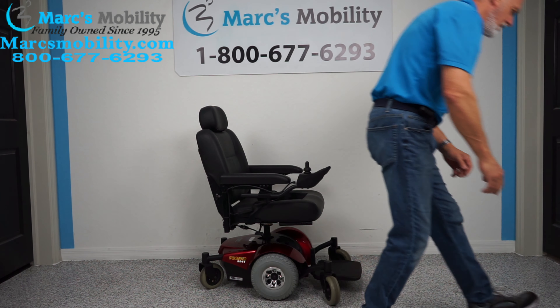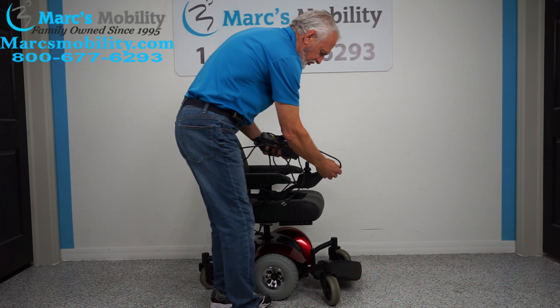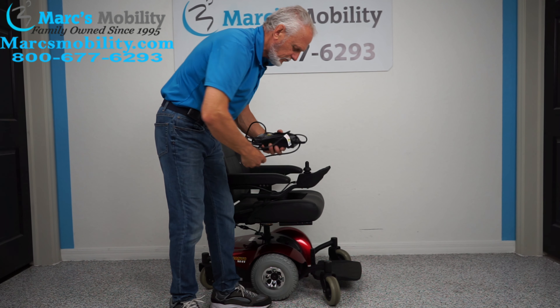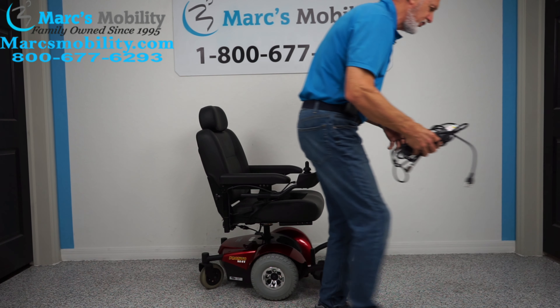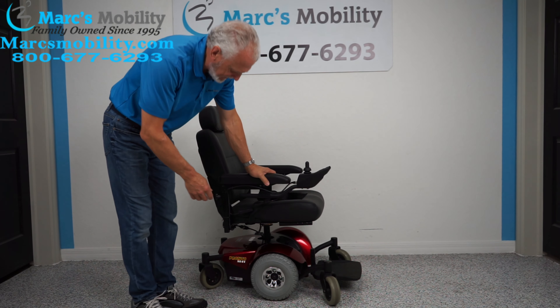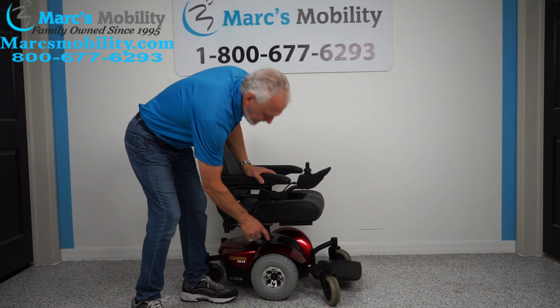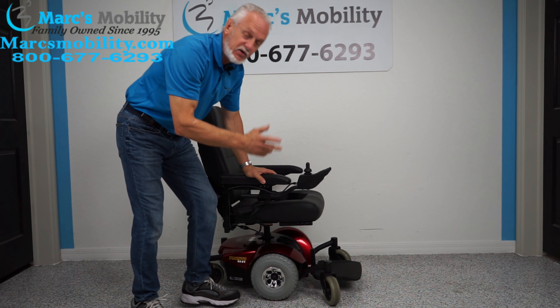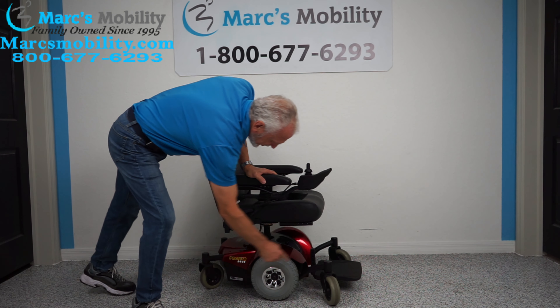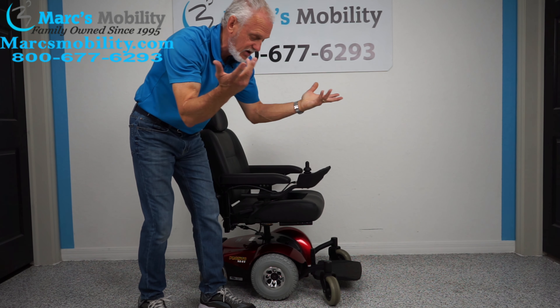When you charge this chair, you plug the charger right below the joystick, and as soon as the light turns green on your charger you're fully charged. There are two batteries in this chair. To take the batteries out you have to lift the handle, pull the seat off, and take the red cover — you'll see the two batteries. The red cover has four screws, one at each corner in the back and two in the front. Four screws and the red cover comes off, the batteries come right out.